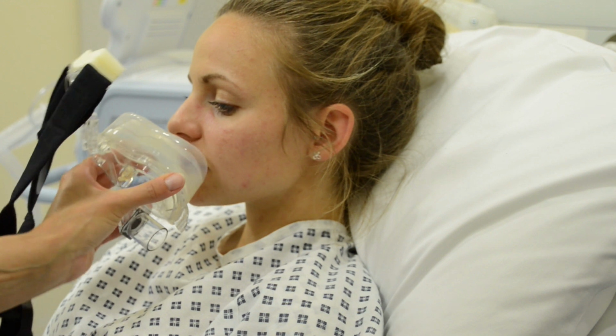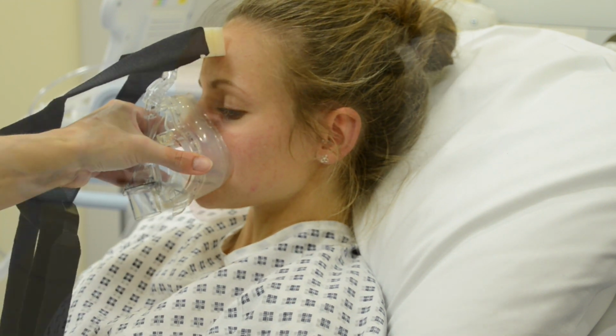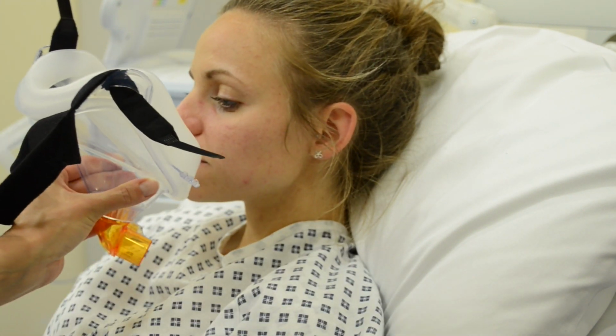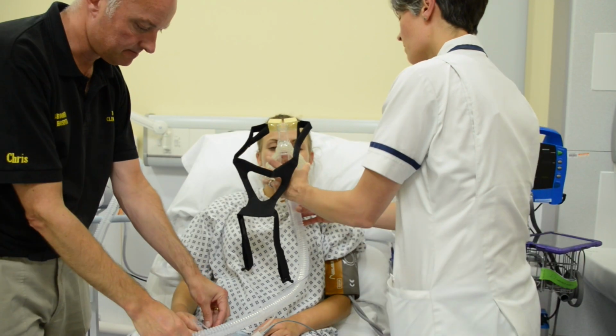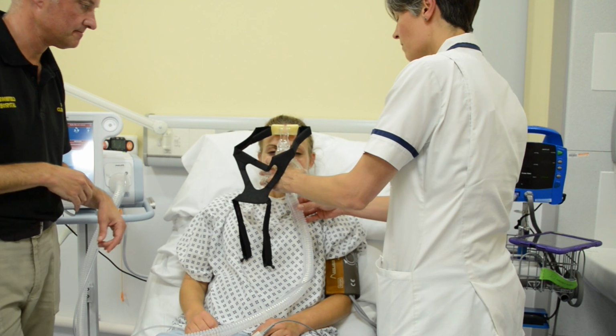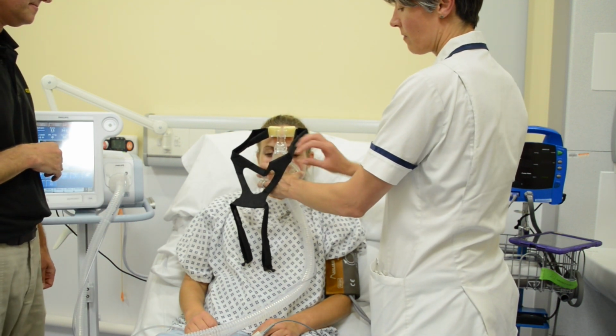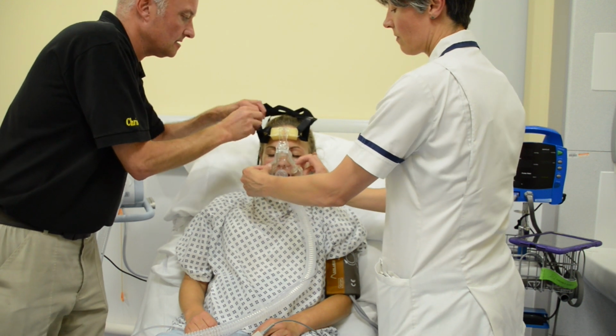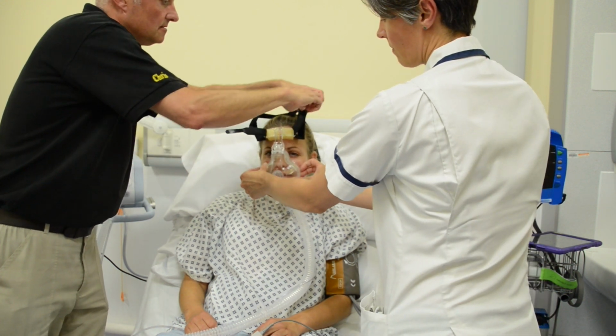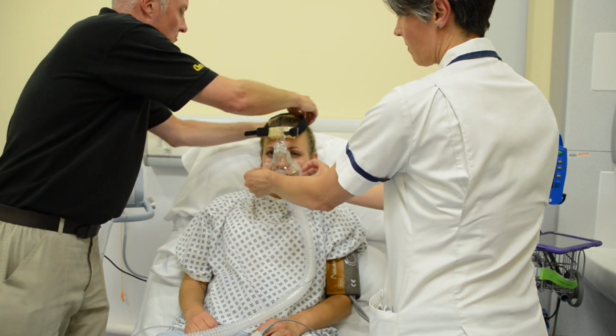Position the bottom edge of the mask onto the patient's chin first, then roll up and onto their face, lifting the lower straps up and over the back of their head. Stop, reassure and gently encourage if the patient becomes distressed or agitated. Stop if the patient withdraws consent.